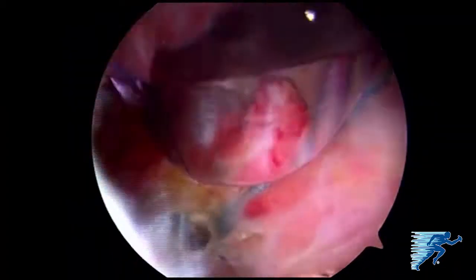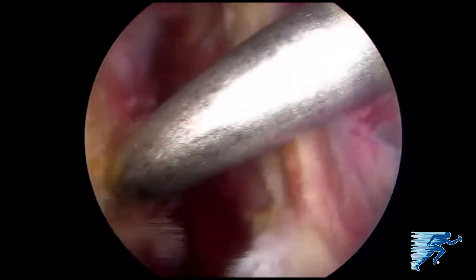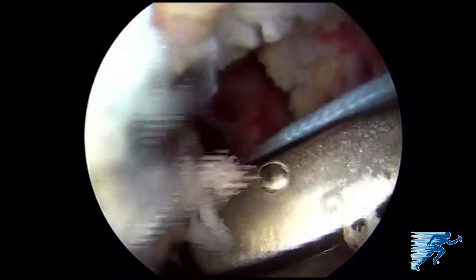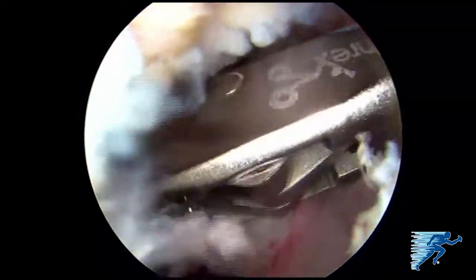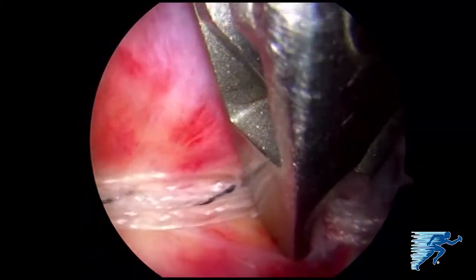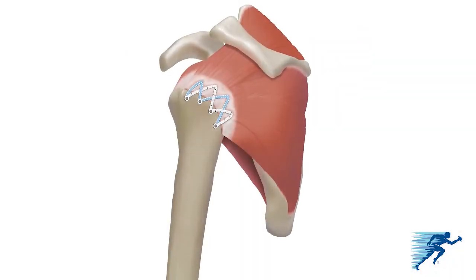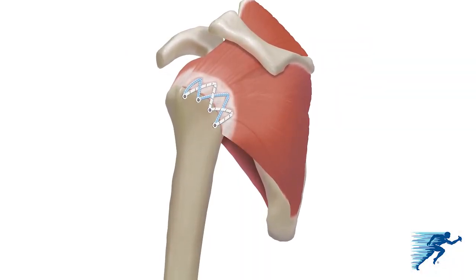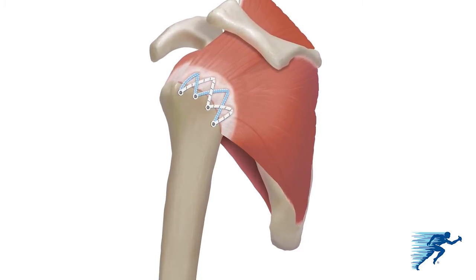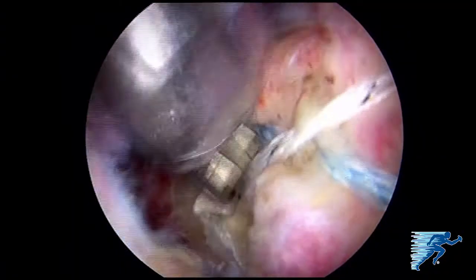We're visualizing from posterolaterally, then from anterolaterally while placing the posterolateral anchor. This linked double row construct offers self-reinforcement and a decreased risk of suture cut-through. Working towards the center, retrieving the two sutures towards the middle. It's important to plan anchor location to ensure enough bone for fixation. The color coding of the fiber tapes — blue and alternating blue and white — helps determine which strands of the medial row are combined in which anchor of the lateral row.